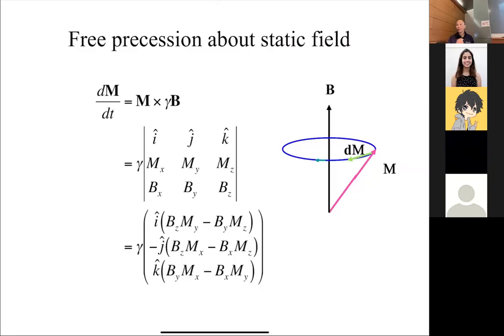Yes. What's the concept behind the flip angle? What is the flip angle? The flip angle is essentially the angle that you flip the magnetization away from equilibrium. So you can imagine that. For now, we're just going to assume that you flip it to 90 degrees, which is the simplest thing. But later on, we're going to see how you can choose different flip angles. And this is the angle caused by B1, right? Yes, that's right.